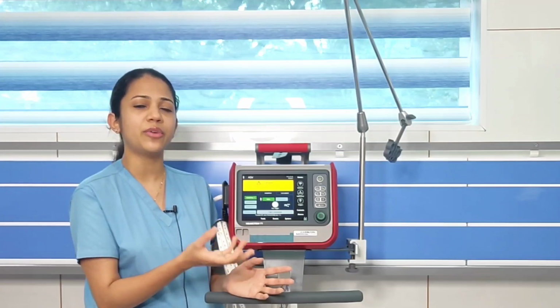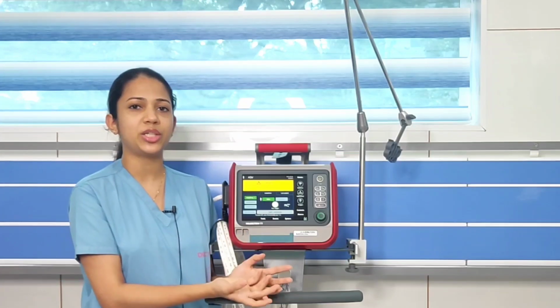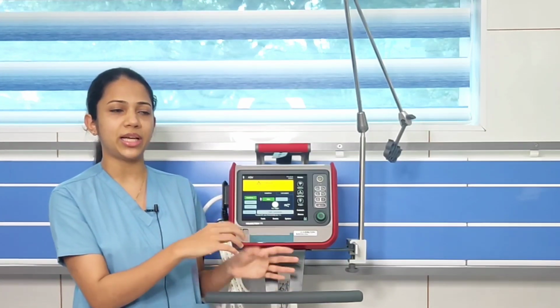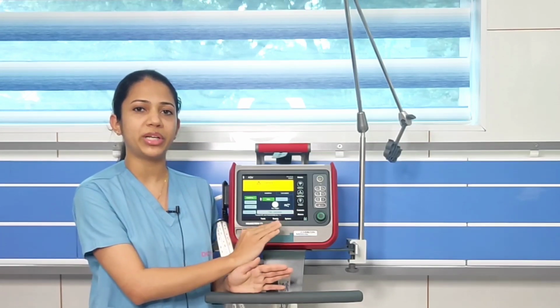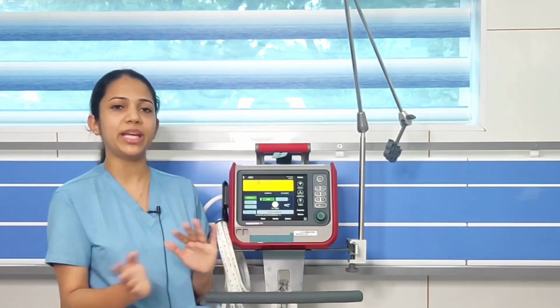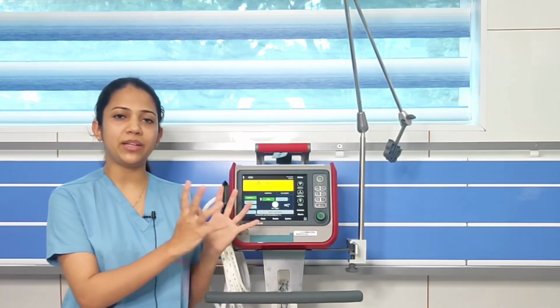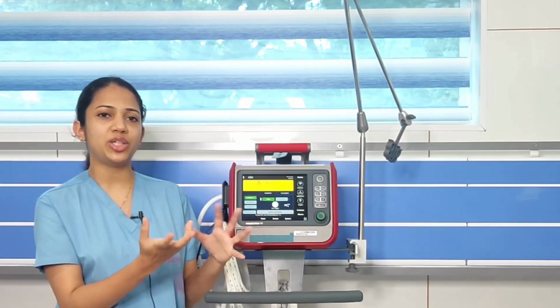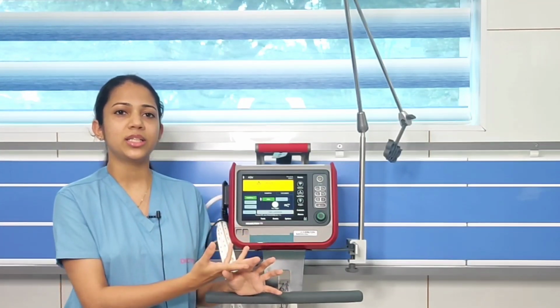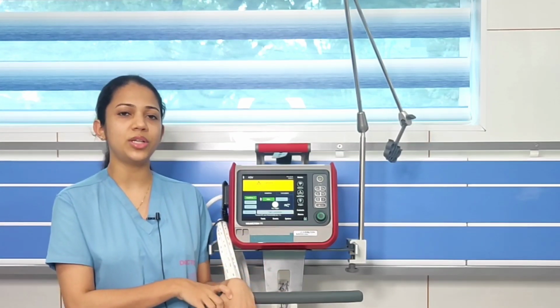Suppose we have intubated the patient for an intracranial bleed or something, and we don't want the patient to trigger and we don't want asynchrony, so we will keep the flow trigger high so that there will not be a change in the flow, so that the ventilator can fully take over and the patient is not allowed to trigger, so that weaning can be delayed. I hope you have understood. Thank you.